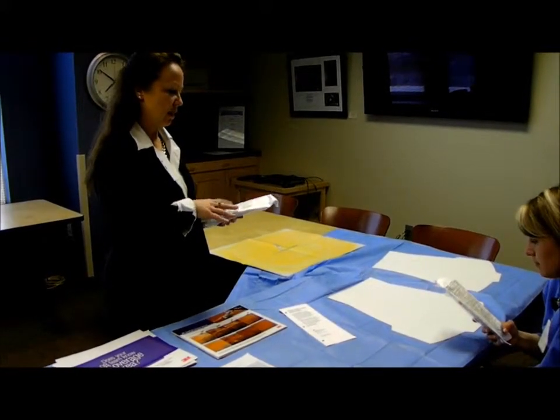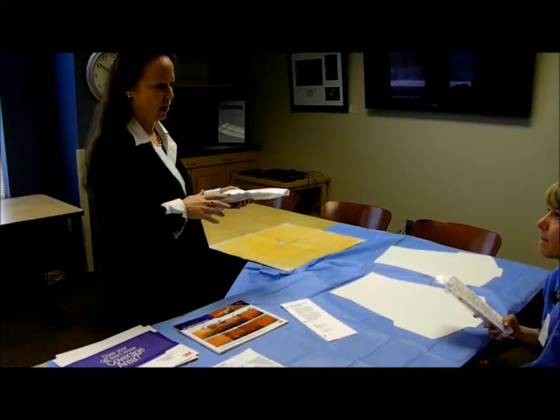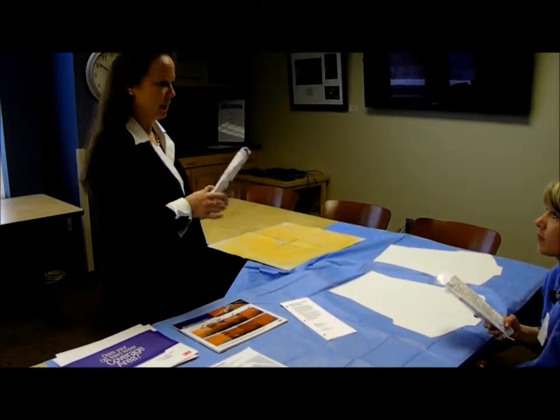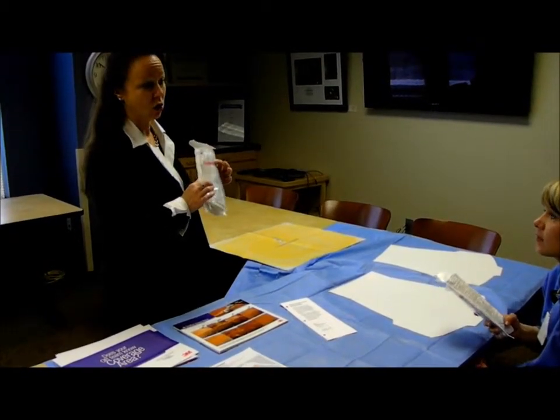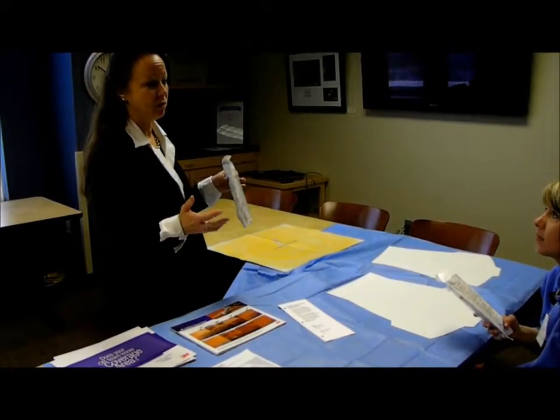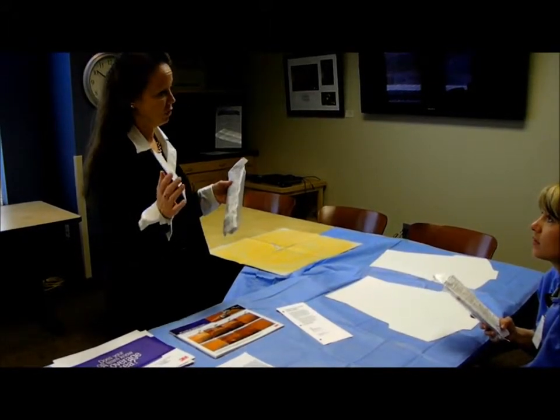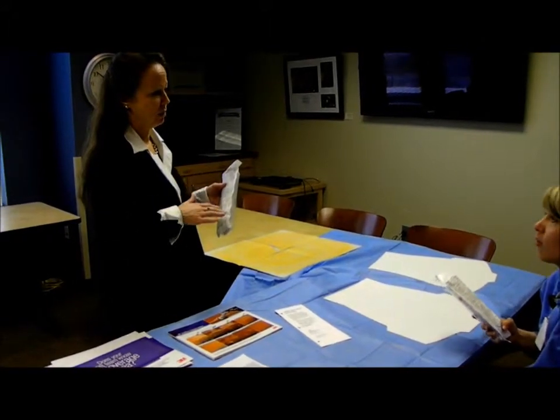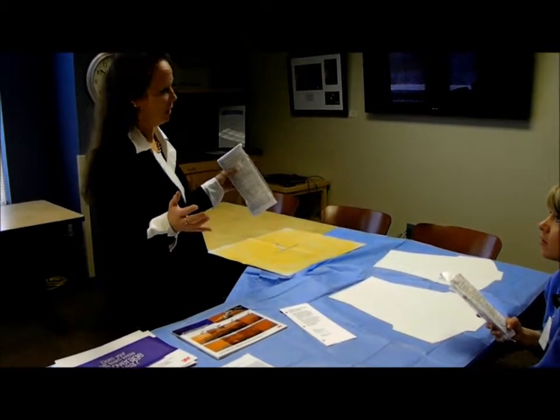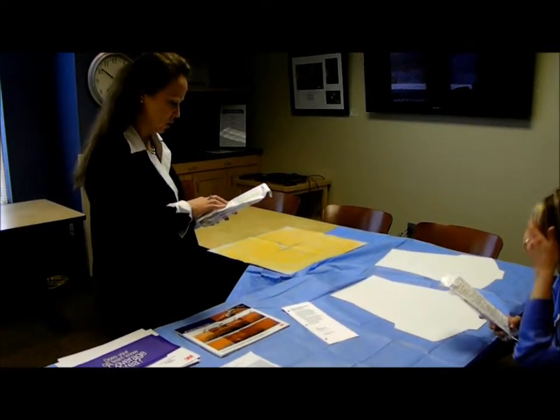If you do shave hair, I understand you do clip, not shave, but that you clip prior to going into the OR. Okay. That's fine, that's good. The only thing you want to remember, because this product does contain alcohol, if it's an emergency or you're not clipping for some reason, there is hair. If you do get the product on hair, the dry time is much longer. It's up to an hour. So you want to be sure to either dry that area with a sterile towel or wait that 1 hour, which you probably aren't going to do. Right. Okay. So clipping is probably what you'll see most often.